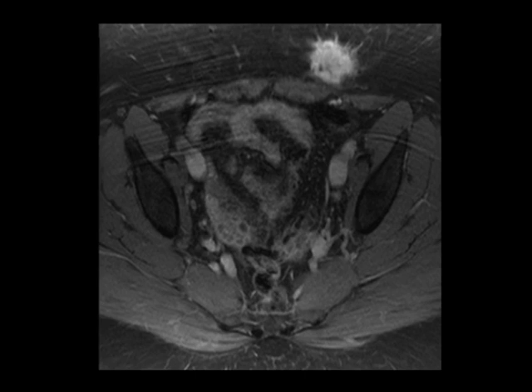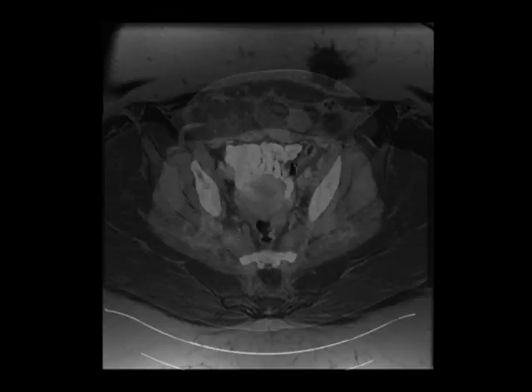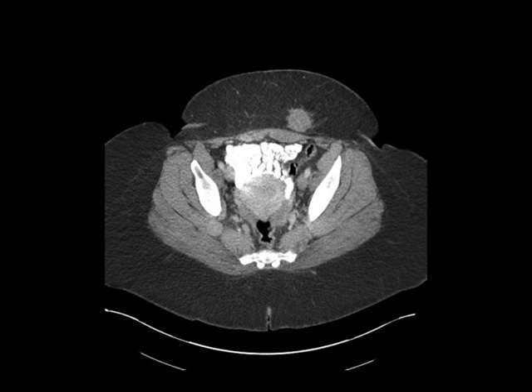It's important to remember that endometriosis in the abdominal wall will not necessarily have the same signal characteristics as what you're going to see in the pelvis. In the pelvis, these lesions are often going to be T1 bright and often will show T2 shading. That is actually not the case for the abdominal wall, because much of what you're seeing is actually desmoplastic reaction and fibrosis induced by the lesion itself.